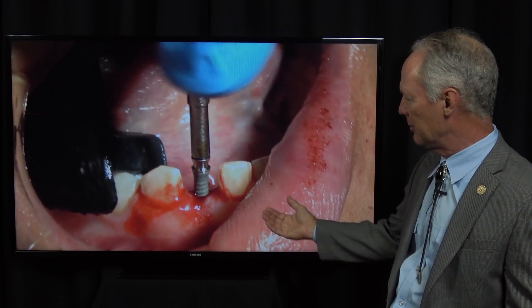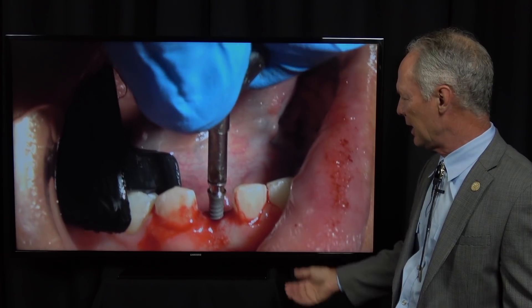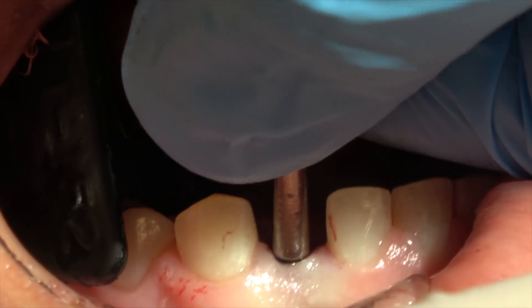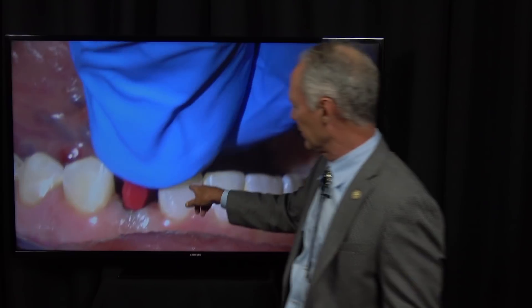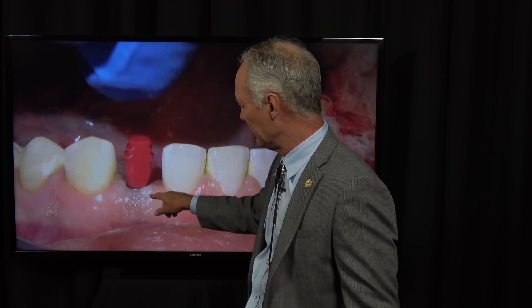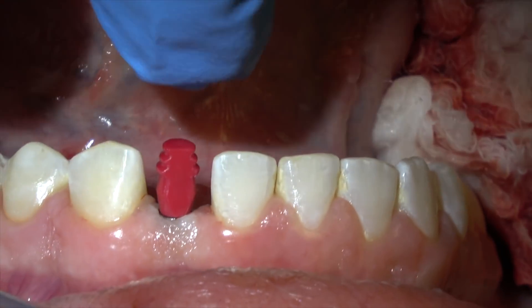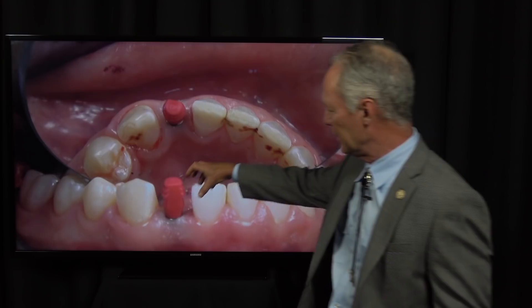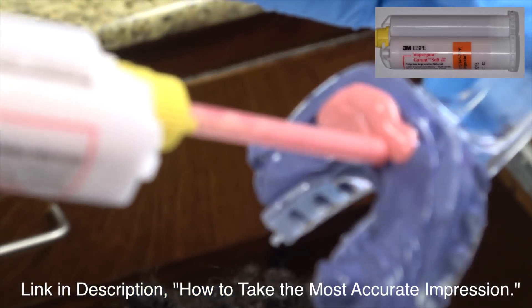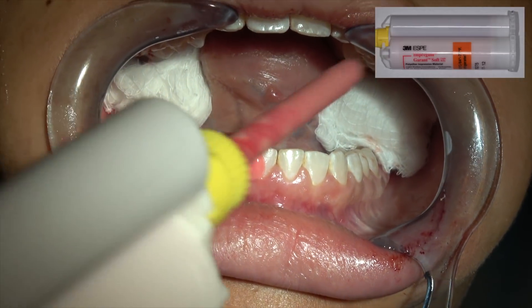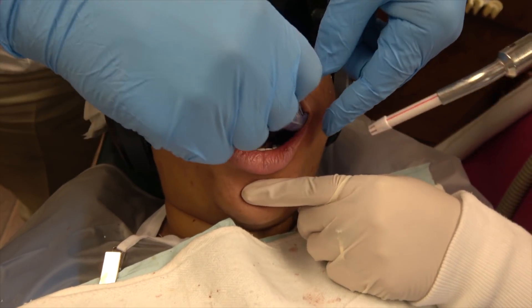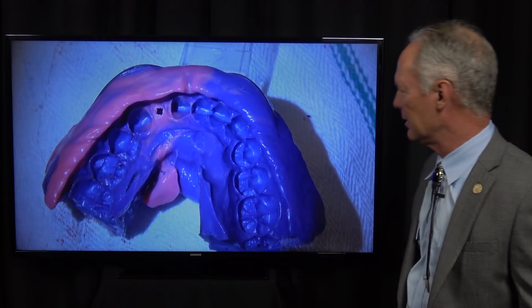You can move it one way or the other, but once you get about halfway in, you can't change it anymore. You can use this tool or a ratchet wrench, and I'll constantly check the alignment of the implant in relation to the two adjacent teeth. The implant is screwed to place, and the shelf is a little bit subgingival. Now this is the impression coping — you put that on the implant and take your impression. This pulls into the impression and is sent to the laboratory. I'm squirting the wash on that impression coping, then seating the custom tray with polyether. The impression coping is pulled into that impression.